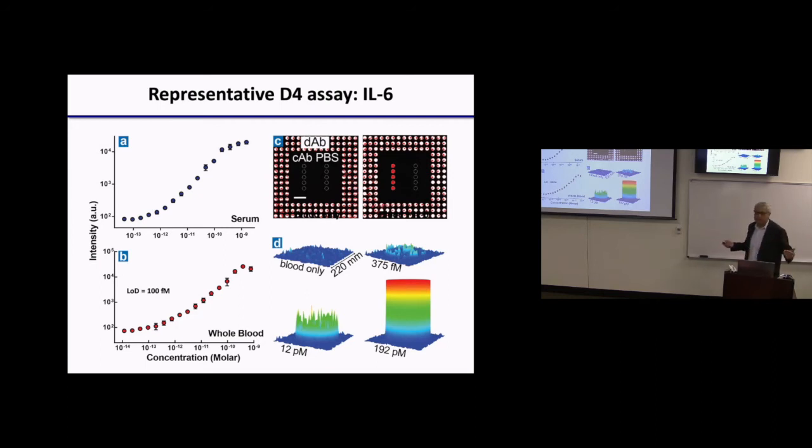But you don't need it at 4 degrees Celsius, and you don't need it to be hydrated. It can be stored dry. In fact, we put in some Drierite in a pouch, seal it, and that's how we store it, and it works really well.